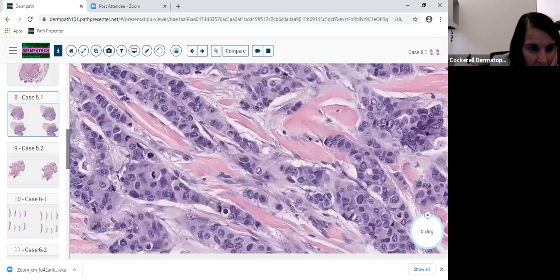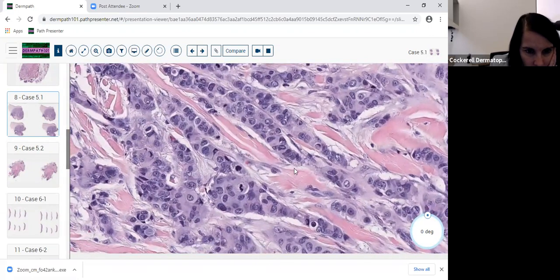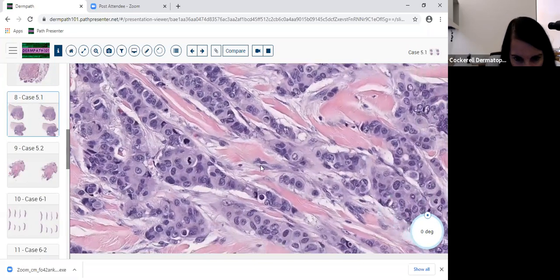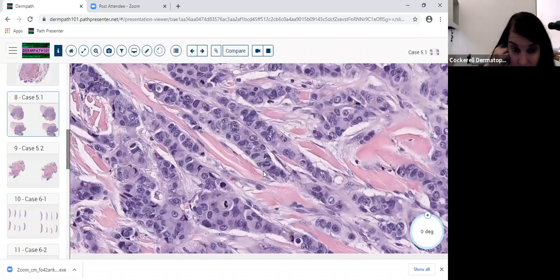And if you look on high power, the highest power we have, you're starting to see mitoses all over the place, high NC ratios. And this is what I mean by high NC ratio and nuclear atypia. And if you have doubts about, well, is this nuclear atypia? Just look around for a red blood cell or look around for a lymphocyte and see that the nuclei of the cells are 10 to 20 times bigger. So try to find a red blood cell.